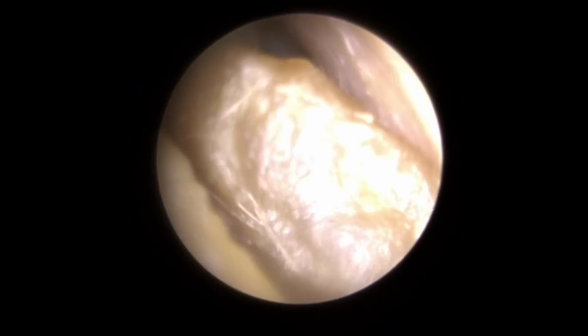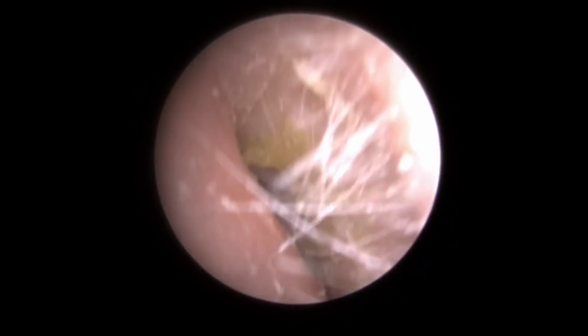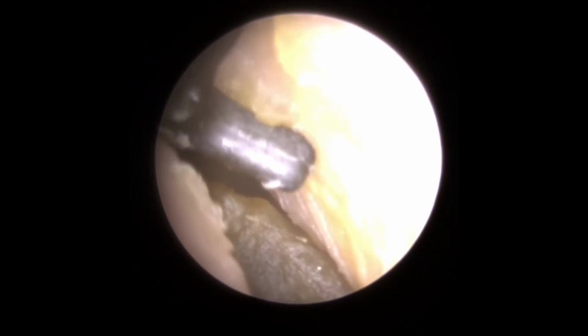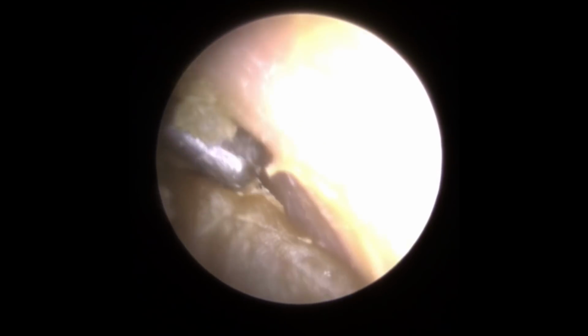But what we'll do now is we're just going to go in and just get this second ear nice and clear now. So you can see I've got the gap there. So I'm trying with the St. Bart's hook, but the wax goes in quite a way, and I don't really want to work blind.